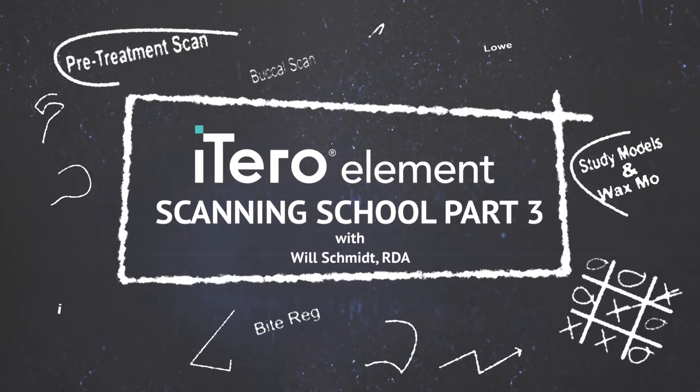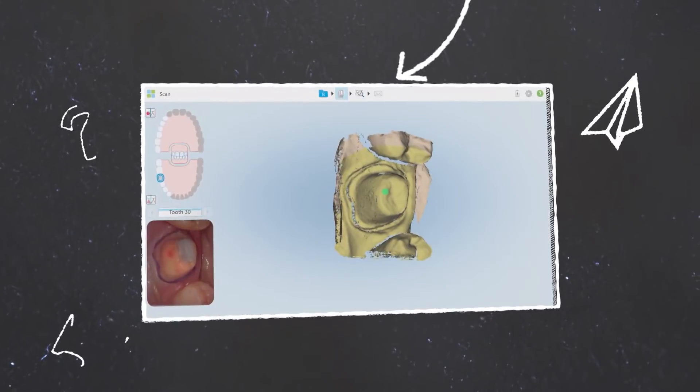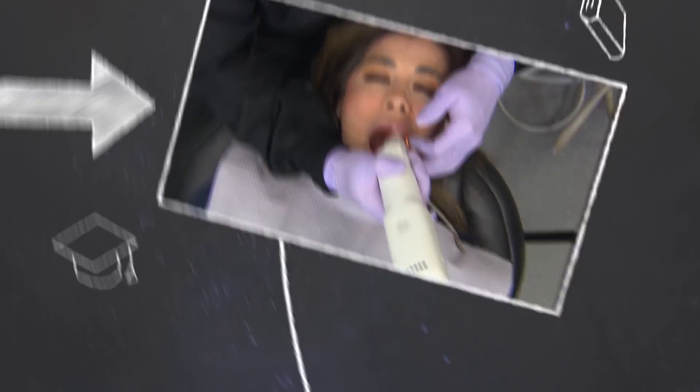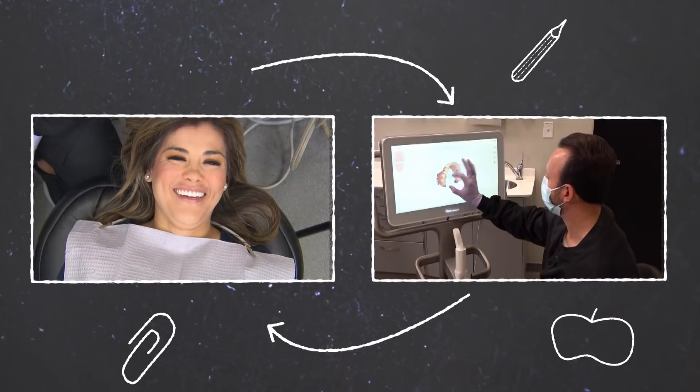Welcome back to iTero scanning school. I'm going to jump right into this single unit crown prep scan for this patient's tooth number 30. If this is your first time watching the iTero Element in action, take a moment and review my previous episodes where I discuss the basics of iTero function and setup to get us to this point.